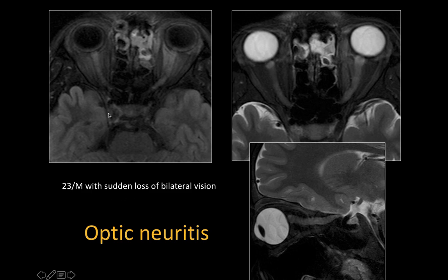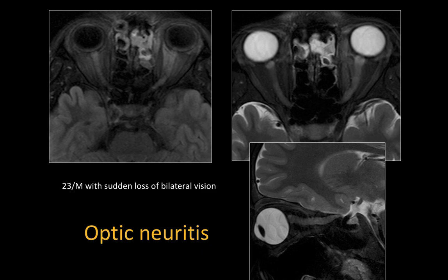This is a 23-year-old male who had sudden onset of bilateral vision loss. We see FLAIR and T2 hyperintense signal involving both the optic nerves along almost the entire extent of the intraorbital part. A sagittal image shows complete involvement of the optic nerve. This is optic neuritis — the nerve is swollen and there is effacement of the subarachnoid space in the optic nerve sheath.